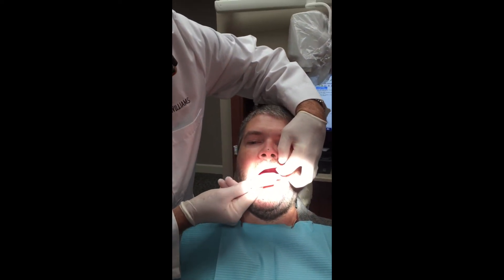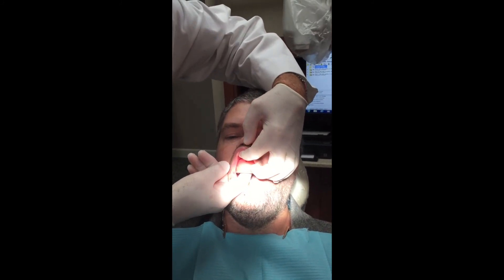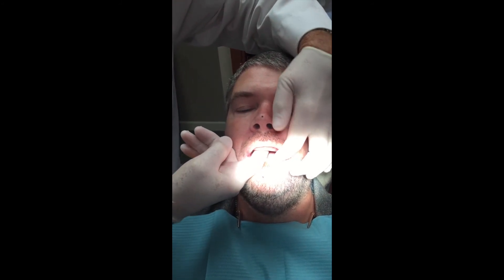Today we're going to talk about wax rims, and my patient is being real cooperative and letting us video in here. You want to always take nice, slow, gentle movements when you put wax rims in patients' mouths because edentulous mouths are sort of tender.